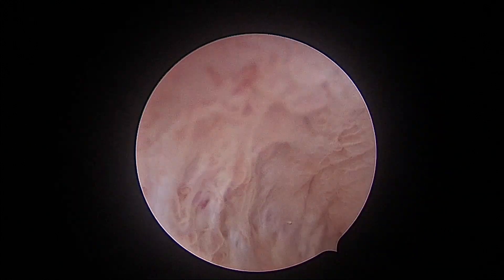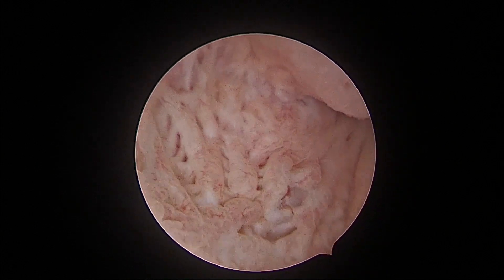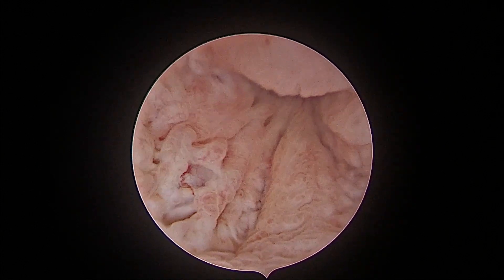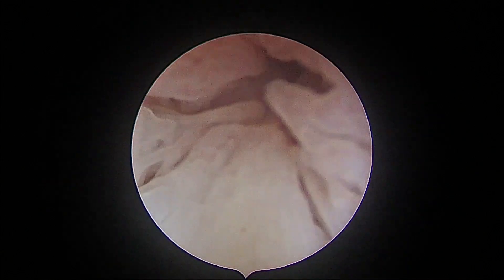Hello, this is Dr. Ameya Padmavar, a Gynecological Endoscopic Surgeon from Mumbai. We are showing you the hysteroscopy of a patient using a 2.9 mm 30 degree hysteroscope with a Beto-ki-5 sheath.